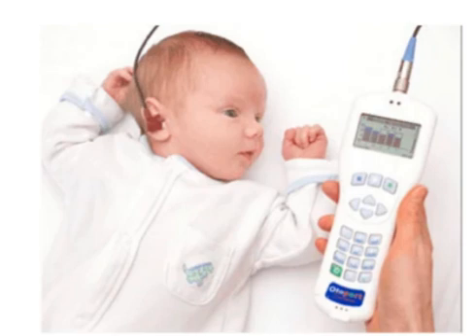Clinical significance. The limitations of OAE screening are the lack of specificity. There is a risk of false positives due to contamination from other sounds, either from the test environment or internal sounds such as breathing and swallowing. During analysis, it may also be challenging to distinguish OAE from background noise. Thus, most OAE requires analysis of the reproducible data and the signal-to-noise ratio of the OAE waveform.